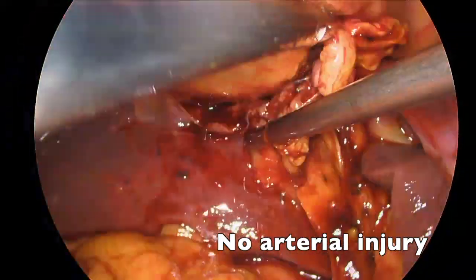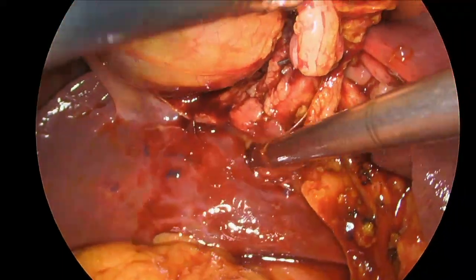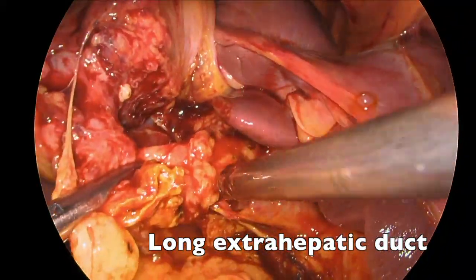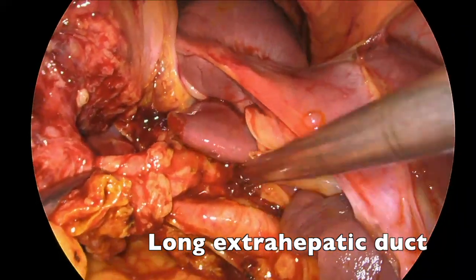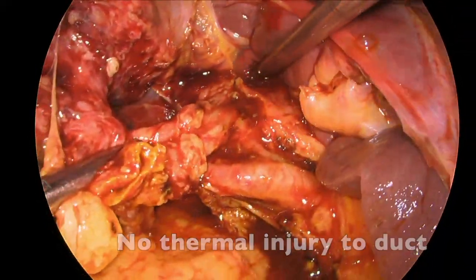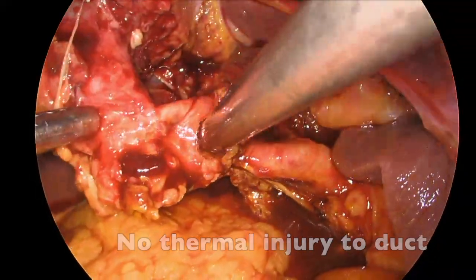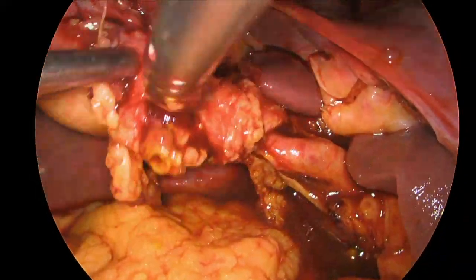We can clearly see the right hepatic artery and further down the porta hepatis, the main hepatic artery branches into the left hepatic. There's a long extra hepatic bile duct making repair more facile, and we can also see that there's no thermal injury to the duct. All of this lines up to allowing for an early repair.